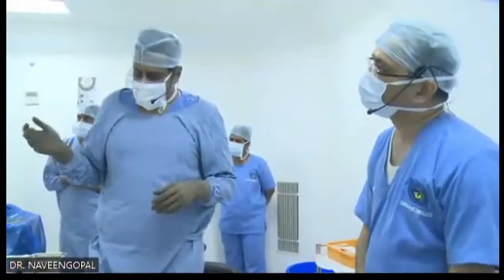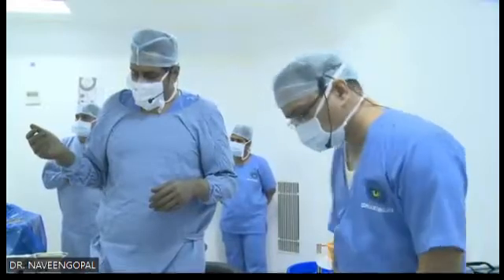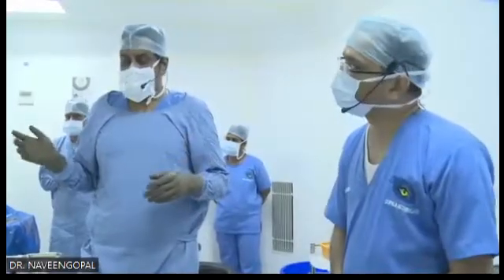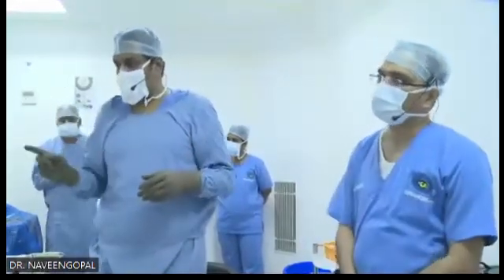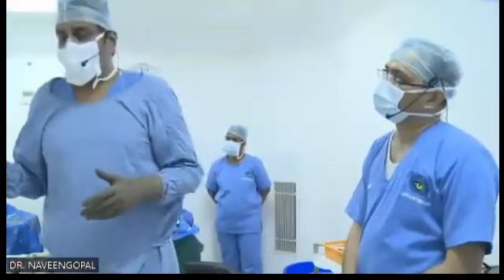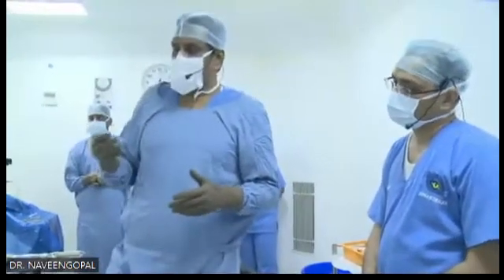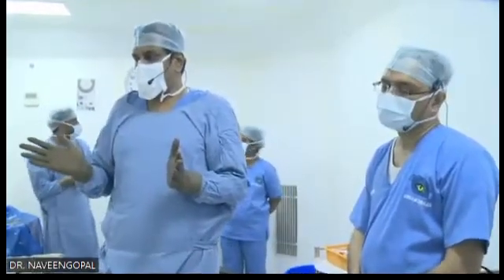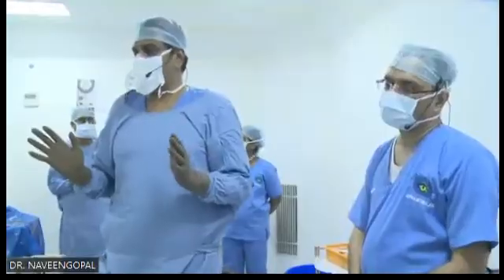It is related to rotation stability in the long term, sir. What about the phakic toric rotation stability in the long term? It's very good, provided your sizing is good. If your ICL is smaller than what your calculation is, then it rotates. Otherwise the rotation stability is quite good.